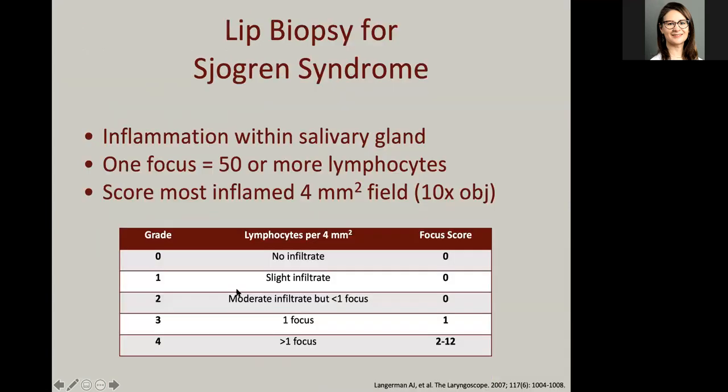Okay, so sometimes you guys will send us lip biopsies for Sjogren's syndrome. And, fortunately or unfortunately, in the patients that have overt Sjogren's syndrome, we don't really see a biopsy. And it's mostly the patients who have an indeterminate, non-diagnostic, vague picture that we get the biopsy. And often the biopsy is also equally vague, non-diagnostic.